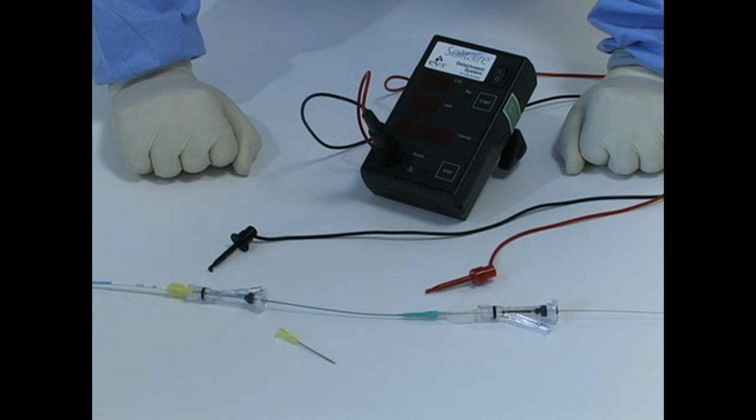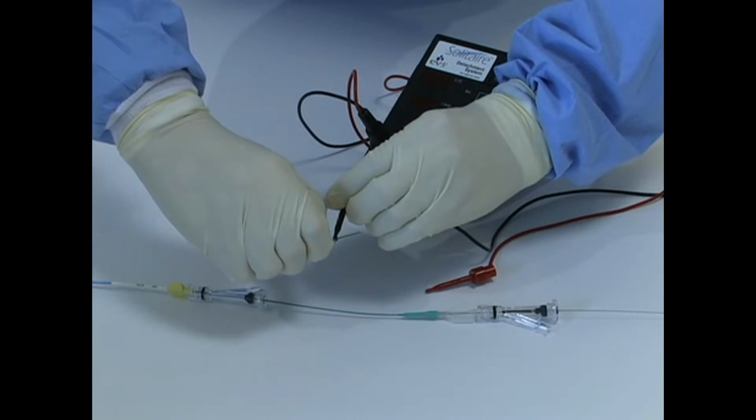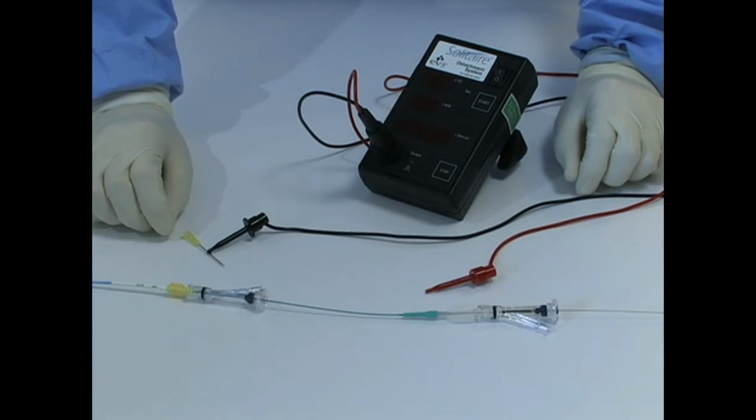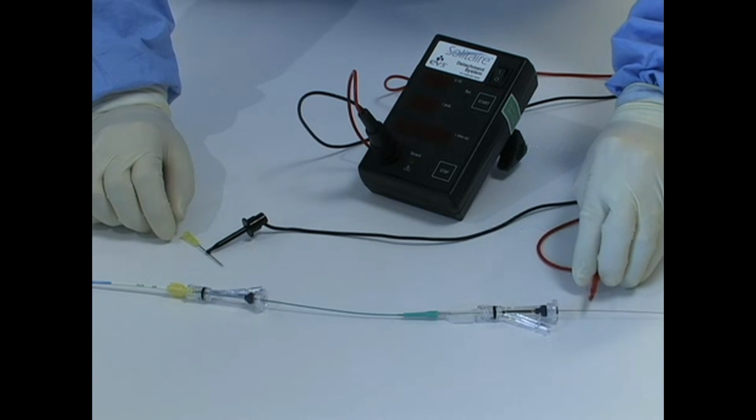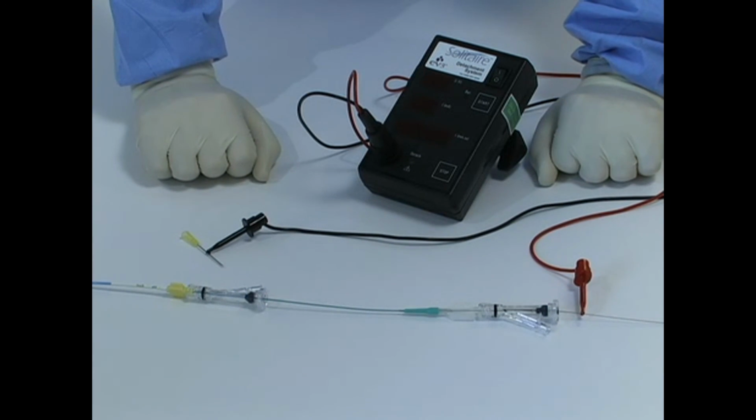Prepare the patient for the procedure by inserting a sterile needle in the shoulder or groin. Plug the cable-set Solitaire into the terminal of the Solitaire detachment system. Clip the connector end of the sterile black cable onto the sterile needle. Clip the connector end of the sterile red cable onto the proximal end of the push wire, making sure the push wire rests on a dry, clean surface.